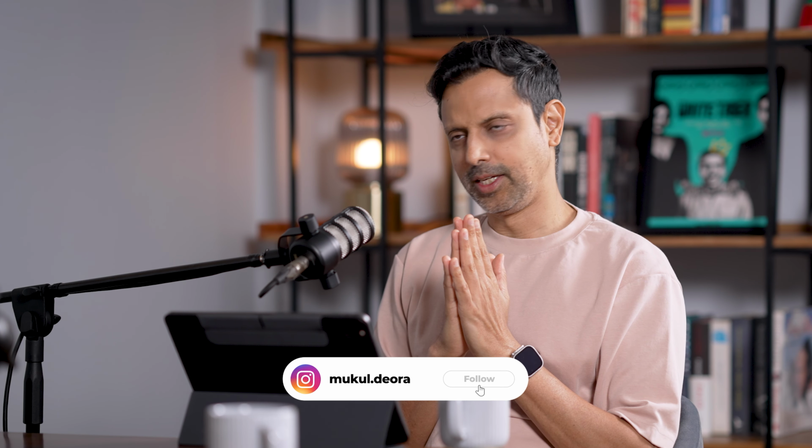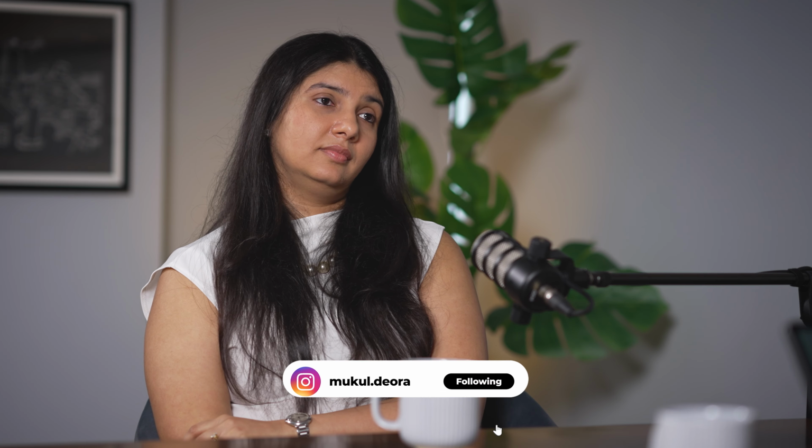But sometimes the worst thing is people forget to take them off at night. And that is a big no-no, because you can get horrendous infections in the eye because of contact lenses. I think that happened to me once, a long time back. So if someone has a late night, sleeps, and forgets to take out their lenses, party a bit too much, and they wake up in the morning and go, oh my God, my lenses are there.